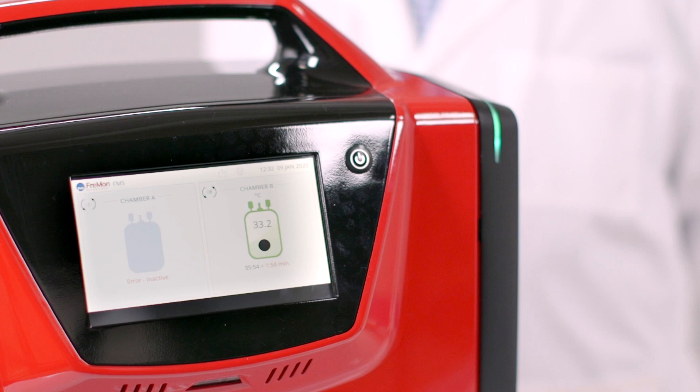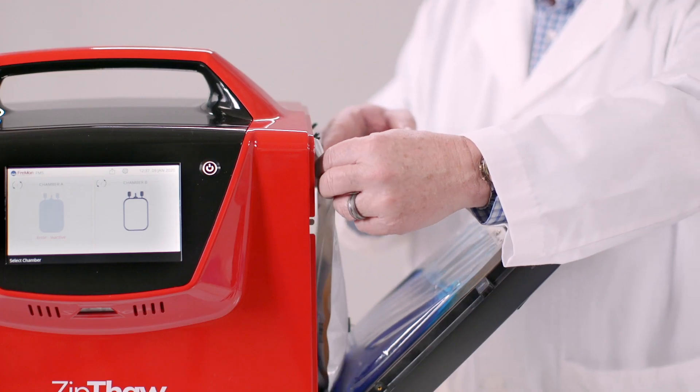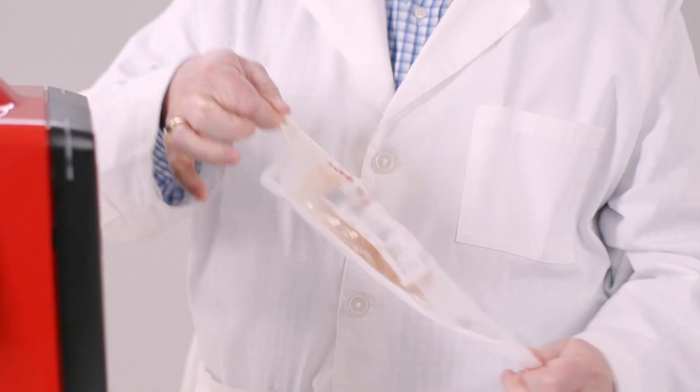When the thaw is complete, the icon turns to green, the chamber light turns to green, and an alert sounds. You're now ready to take out the thawed plasma, now at 33 degrees Celsius and ready for transfusion.